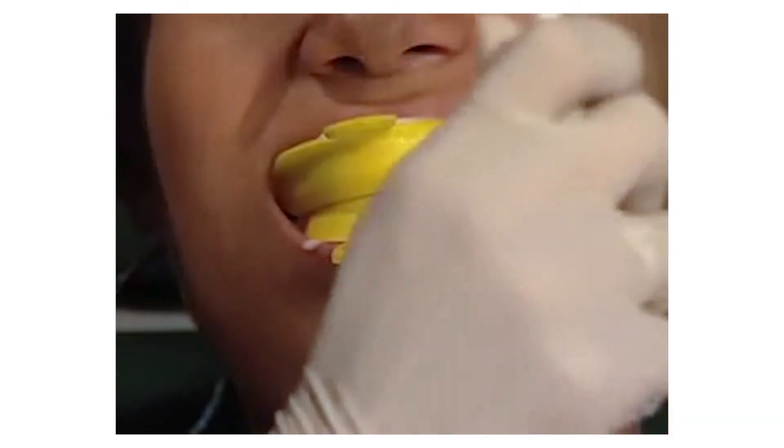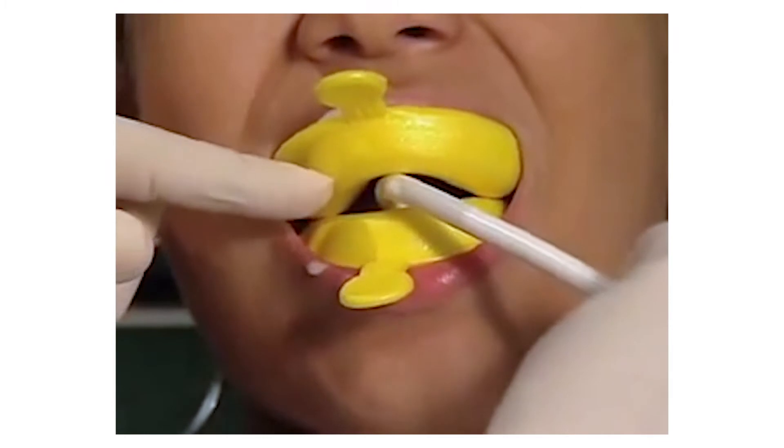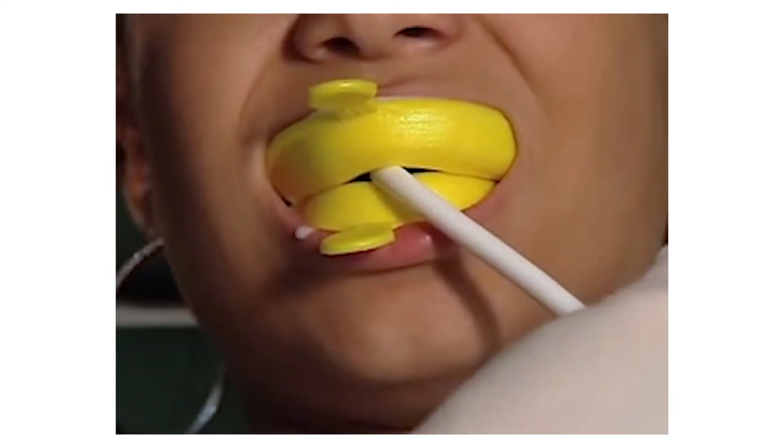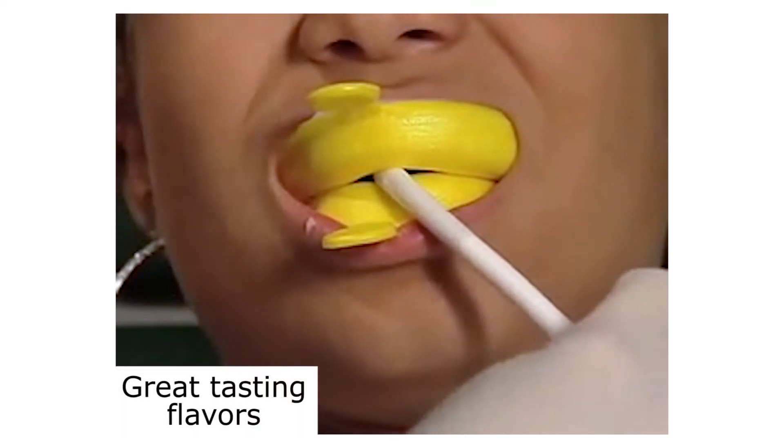I'm going to have my suction ready — I do like to do that. I'll even let the kids hold that for me. Open for me just a little bit and close back down. This is a 60-second application. We're using the cotton candy flavor, which comes in all different flavors — blue raspberry is one of my favorites as well.